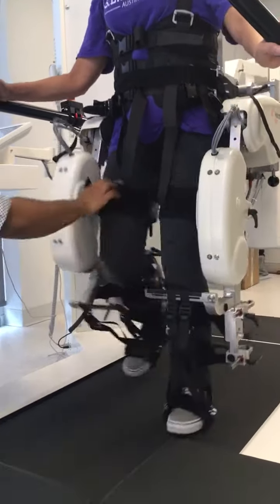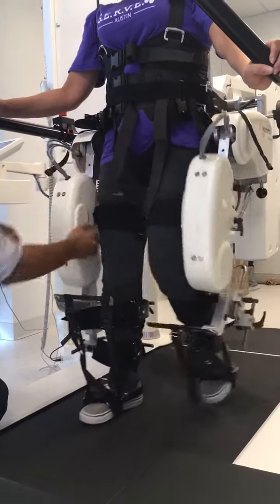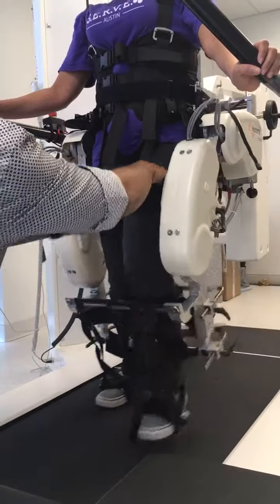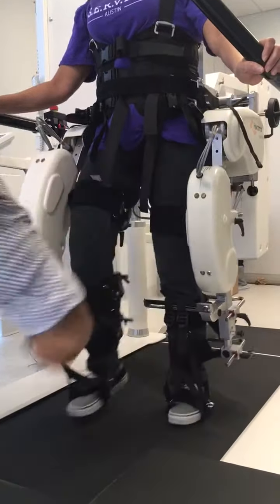Also, one of the first things that we have to do is to make sure that these tops are tightened. They get a little bit loose because, of course, the volume of the leg changes from being static to having some actual movement.